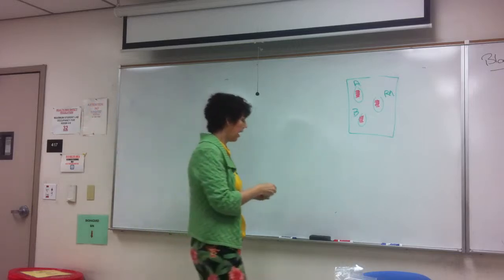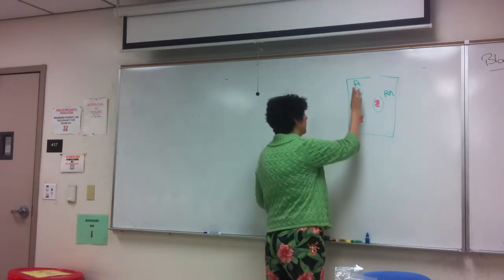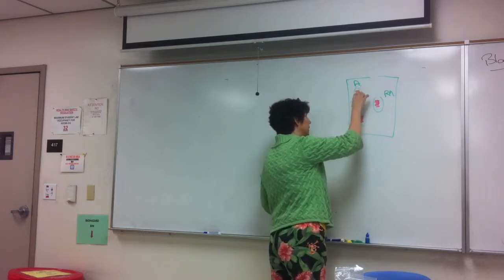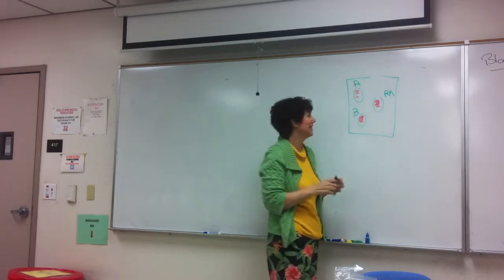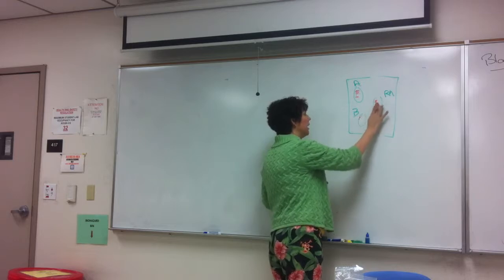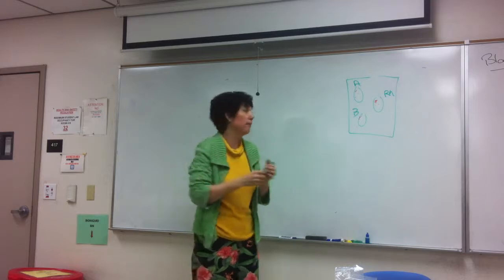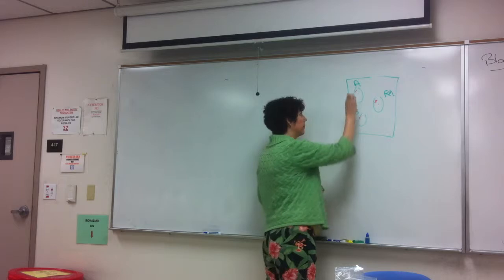So put 1 to 2 drops of each of these in here, and mix it up with a toothpick. Well, that's erasing it, but anyway. Oh, at the same time, right? So you do a different toothpick for each vial. All right, and if you are looking for it, it won't exactly show as dots, but it'll get thick and not flow very well. And so it will have agglutinated, not clotted, but agglutinated.